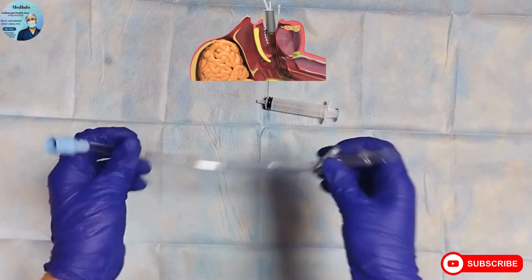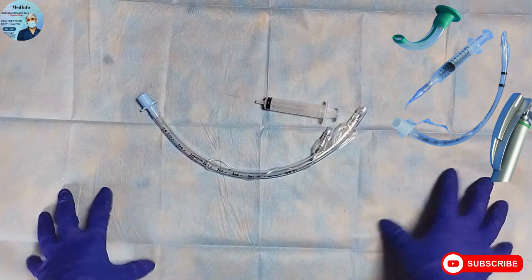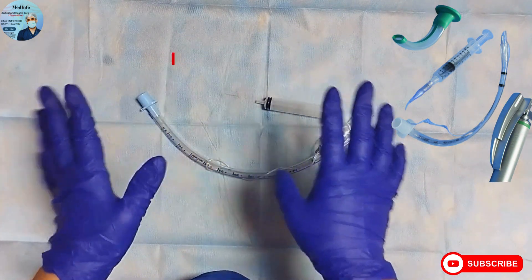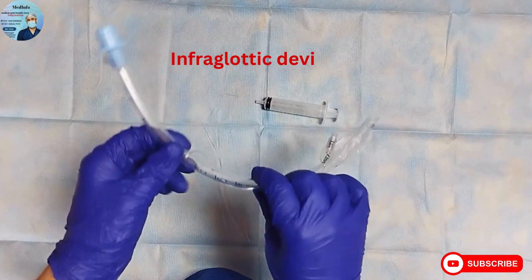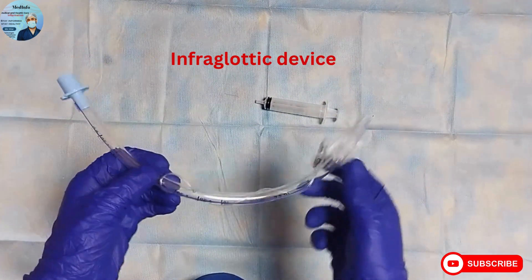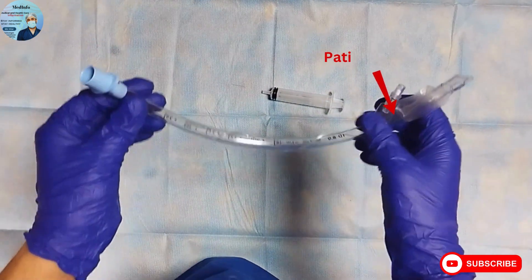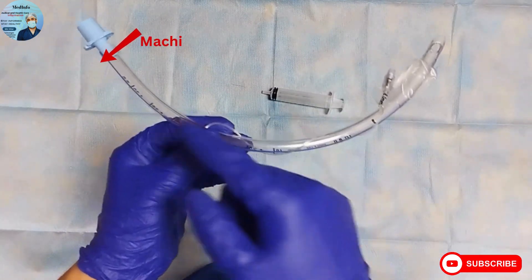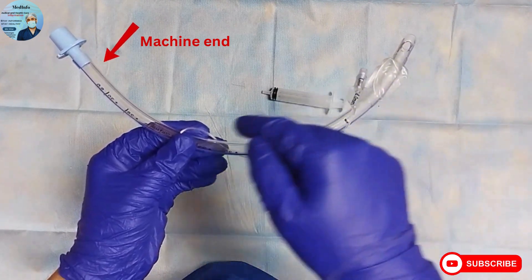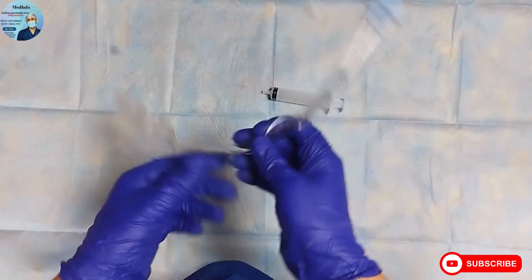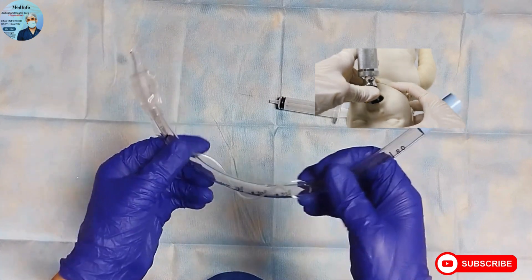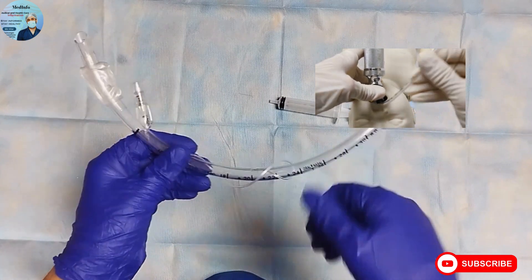Hello viewers, in today's video we are going to learn about parts of endotracheal tube, which is an infraglottic airway device. Endotracheal tubes have two ends: the distal end or patient end, and proximal end or machine end. It is a curved device which is placed through mouth or nostril and is used for intubation.